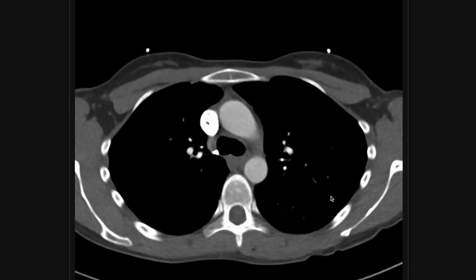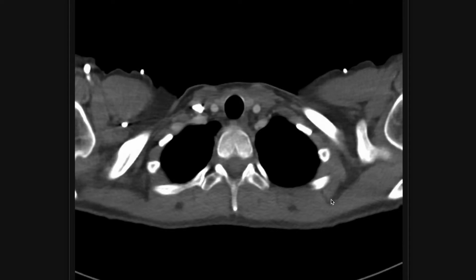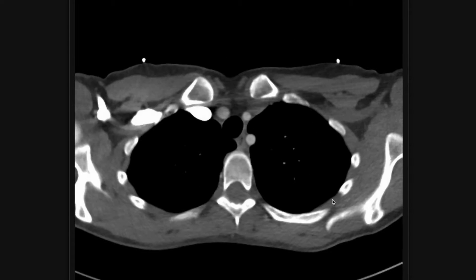That is my search pattern and basic approach to the CT chest pulmonary embolism study. I'm now going to go over to a couple of positive studies to show you what pulmonary emboli actually look like.